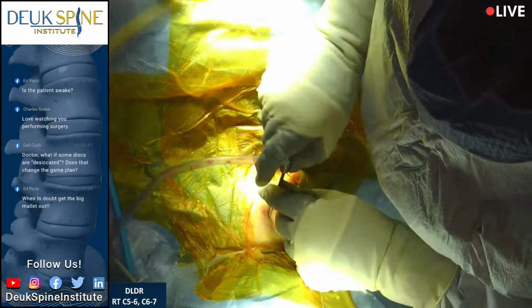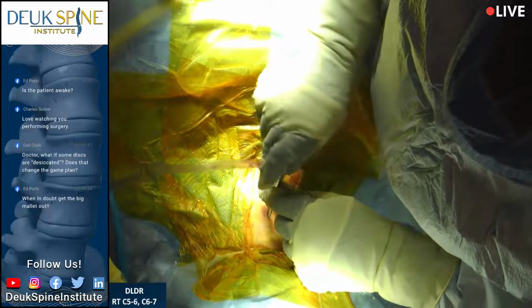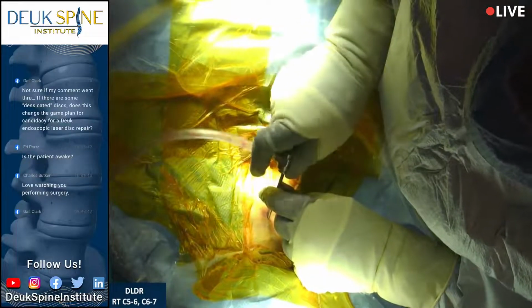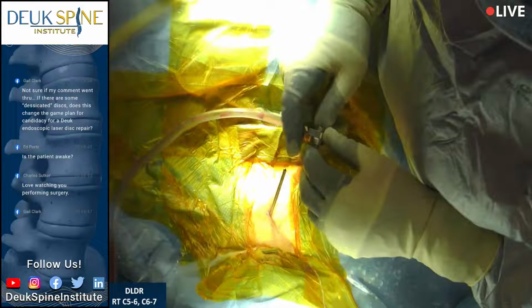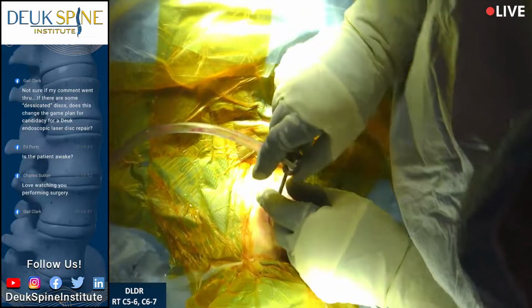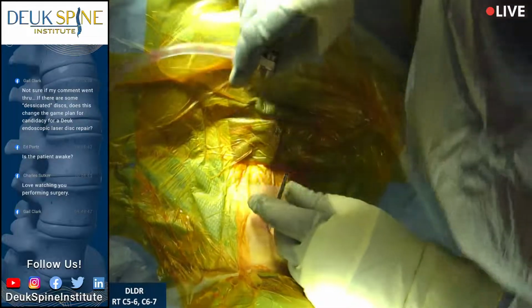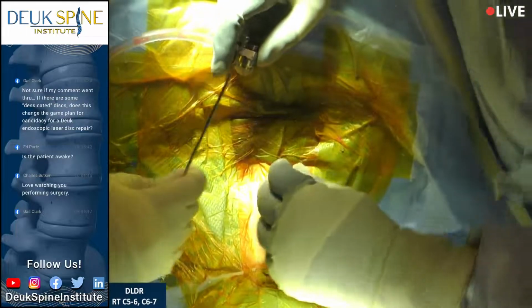And we have to adapt. We're in the middle of surgery. We don't have the luxury of doing certain things, but we have to keep going and finish this patient's surgery. We may have to change the tube out. I'm very close.